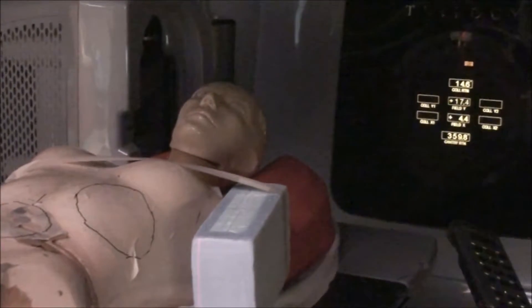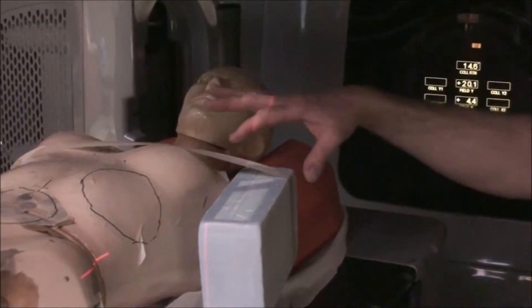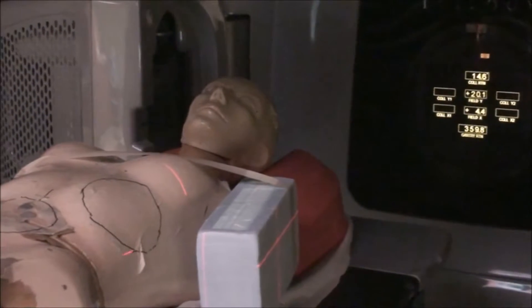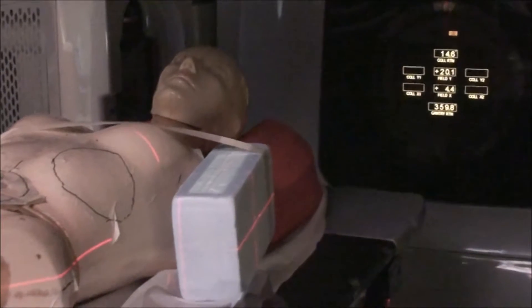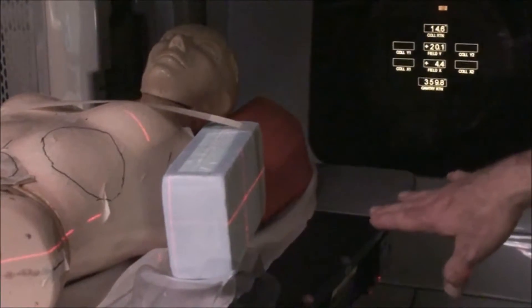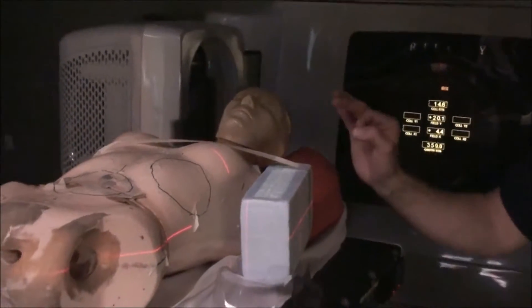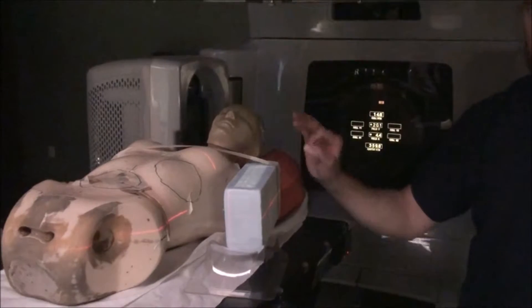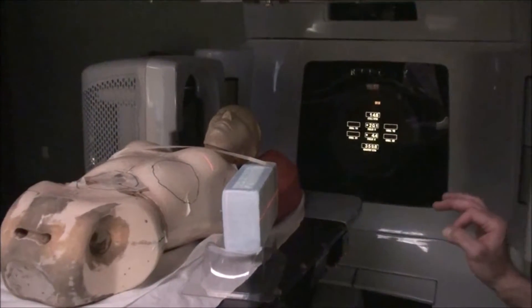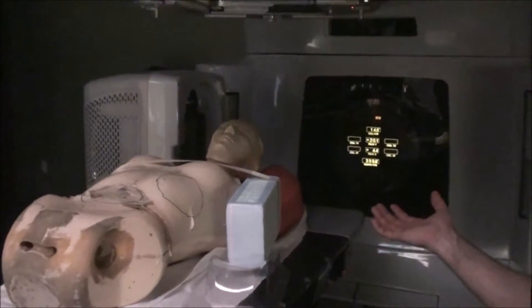Set the field length appropriate for what you've discussed with the physician. Sometimes they'll tell you to treat the entire humerus; sometimes shoulder to mid-humerus. Whatever they've decided, try to replicate that ahead of time. Once you've got everything pretty much set up and ballparked, also ballpark them in the posterior — pretend the styrofoam is the thickness of the patient, so the laser falls halfway. Once you've decided where everything needs to take place, take a separation and set a proper SSD. Bear in mind that if you move in at any time from there, you'll have to retake your separation and reset your SSD. Once you've got your separation, calculated your SSD, and set the anterior SSD, you're ready to film.